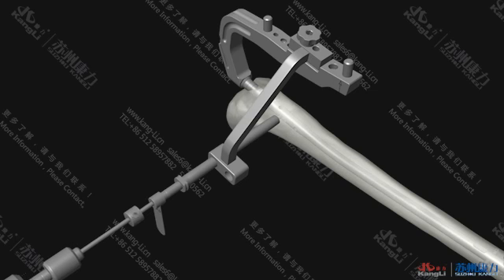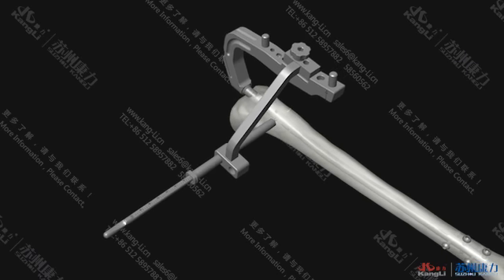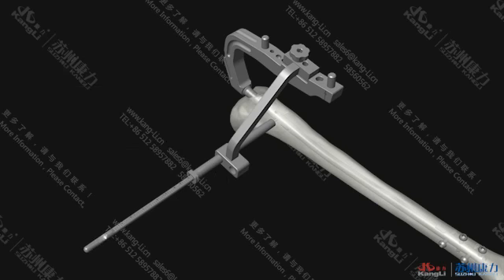Remove the phi 4.0 drill bit and phi 4.0 inner sleeve. Keep the outer sleeve closely contacted with the bone cortex and insert the guide depth gauge to measure the diameter of the bone. Choose the phi 4.5 locking screw with appropriate length and screw it in with the 3.5 hexagonal screwdriver.